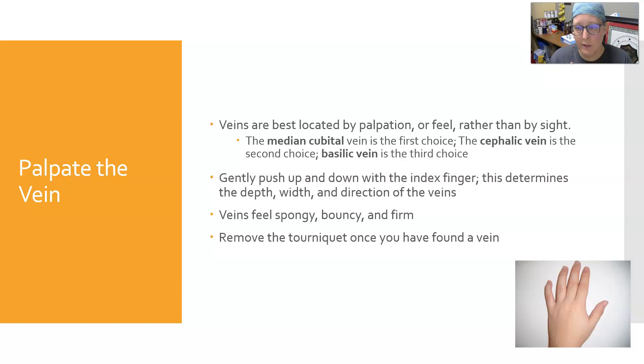Gently push up and down with the index finger on the vein. This can help determine the depth, width, and direction of the veins. Veins will feel spongy, bouncy, and firm. Then remove the tourniquet once you have found a vein.